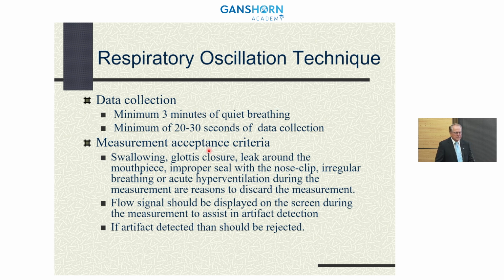And as far as acceptability of the data itself that you're analyzing, you want to make sure that they're not swallowing, that they don't have glottic closure, that they don't have a leak around the mouthpiece, that they don't have irregular breathing. It's nice if it's just very quiet, stable breathing.